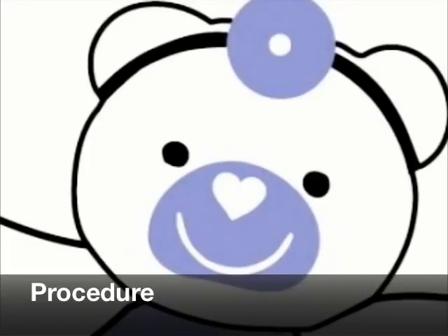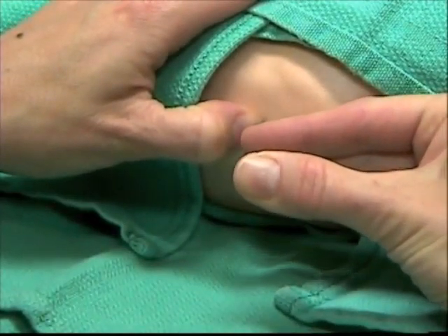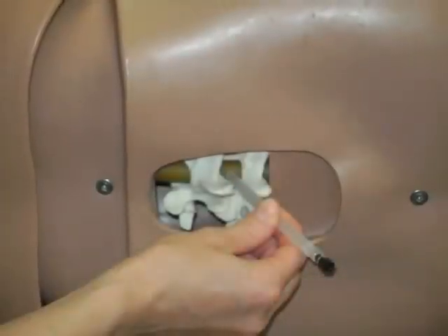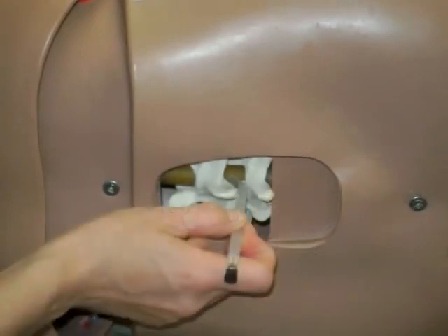Make sure that you are comfortable. Many people prefer to be sitting during the procedure, in which case it is important to make sure the surface that the infant is on is at an appropriate height. Stabilize your dominant hand on the baby's sacrum and aim towards the umbilicus. You should aim towards the umbilicus so that you can pass between the spinous processes. If you go in perpendicular to the skin, you are much more likely to hit bone, as you can see in this model.